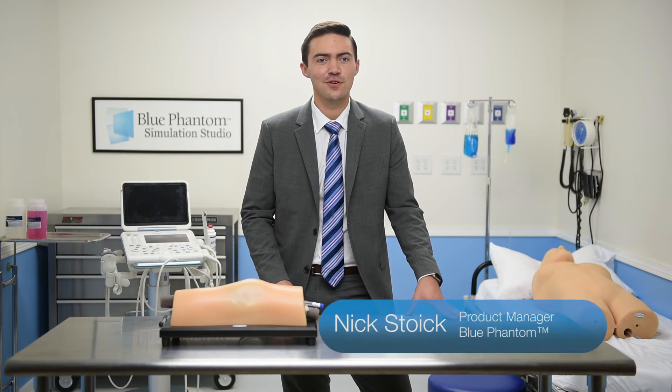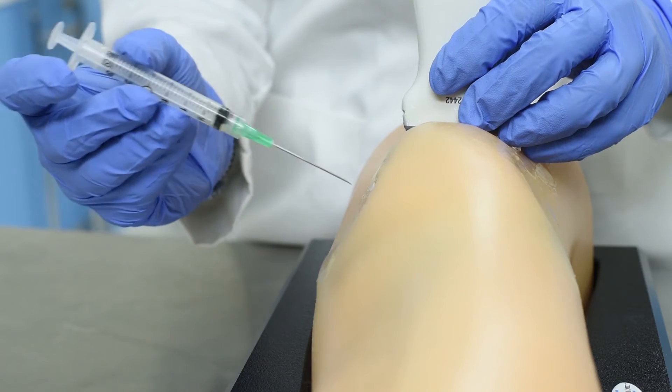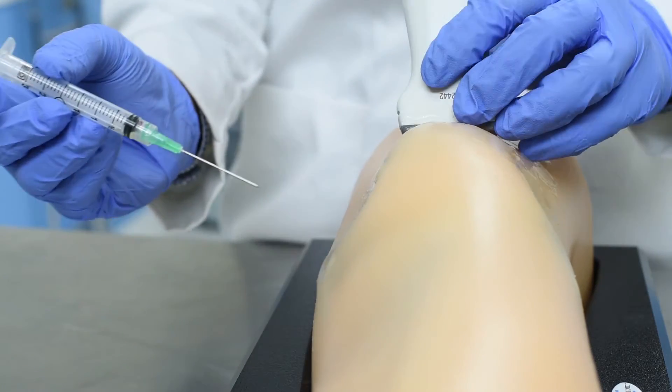I'd like to introduce you to the world's first musculoskeletal ultrasound training model for joint injection and aspiration of the knee. This model features the same realism, quality, and durability that you've come to expect from Blue Phantom.